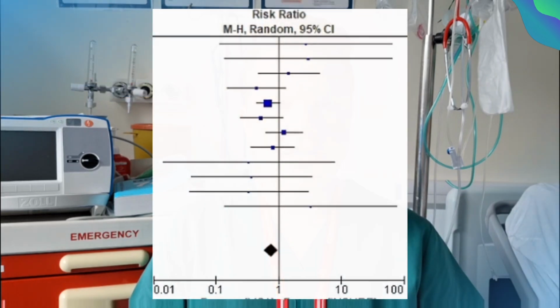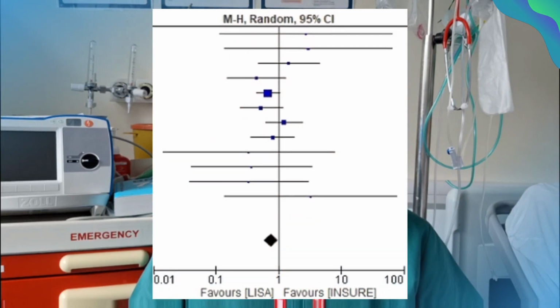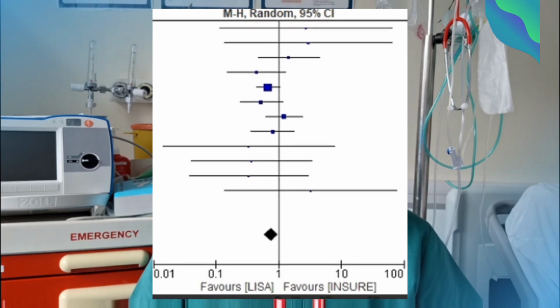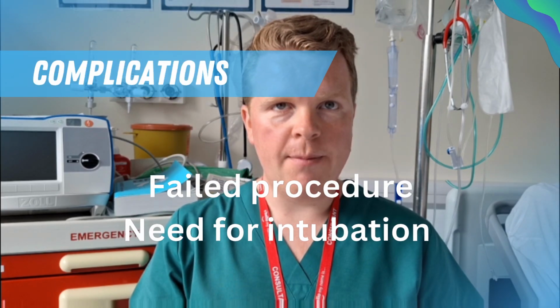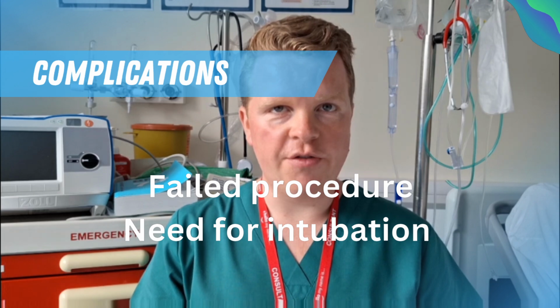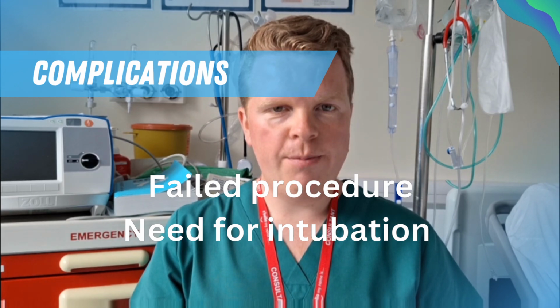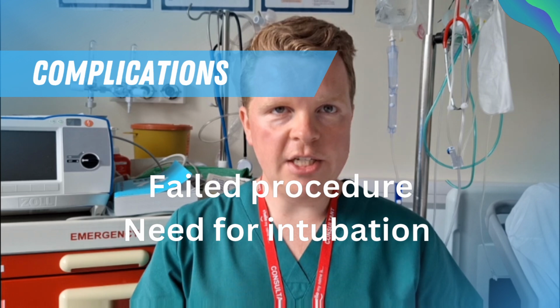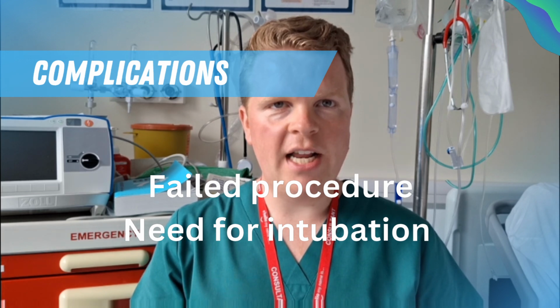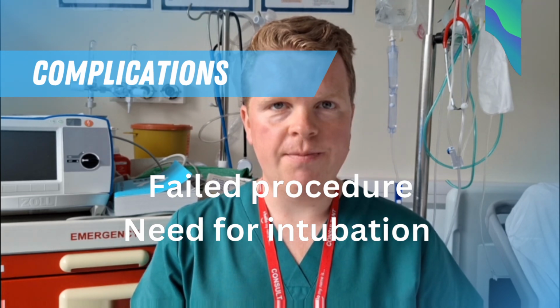The main benefit of LISA is in avoiding the need for mechanical ventilation, and there is strong evidence that it reduces the rates of bronchopulmonary dysplasia compared to mechanical ventilation. The main complication is a failed procedure, administration of surfactant into the esophagus, and a later need for repeat LISA or intubation and mechanical ventilation. But this risk is reduced with improved familiarity and training in the procedure.